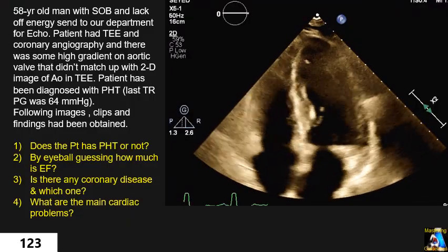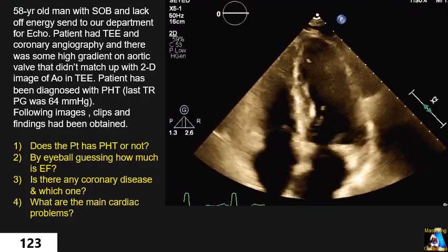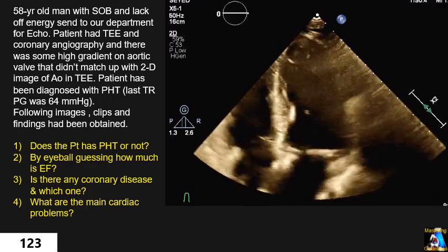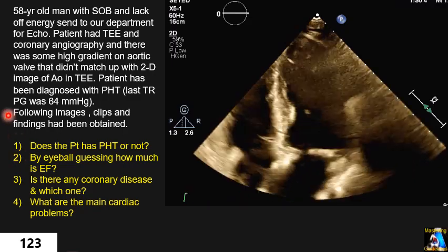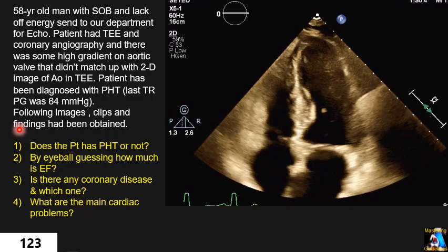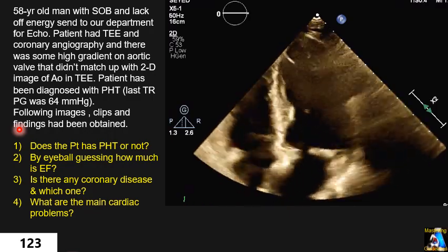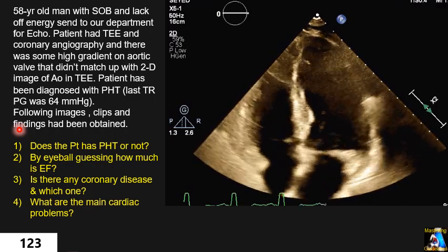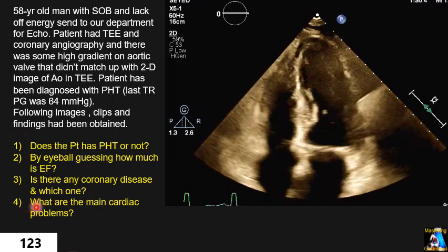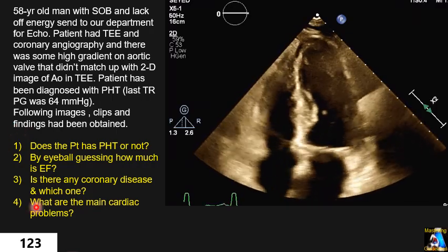Hi everyone. In this case study you will get a lot of tips, information, and knowledge. It is actually a very good case study. There is a patient, 58 years old, presenting with shortness of breath and lack of energy, getting tired easily. They were sent to our department. The patient had done a TEE and coronary angiography in the cath lab.